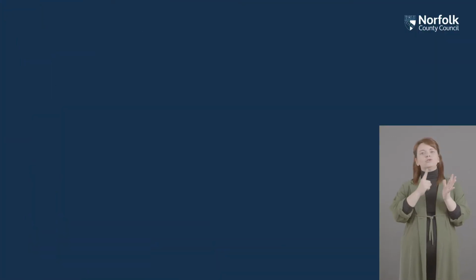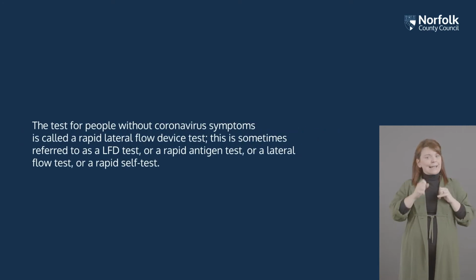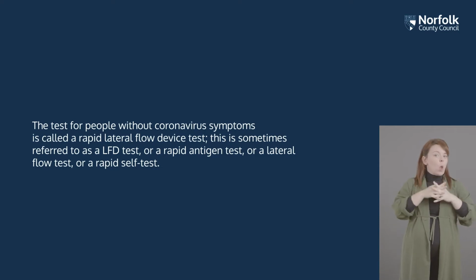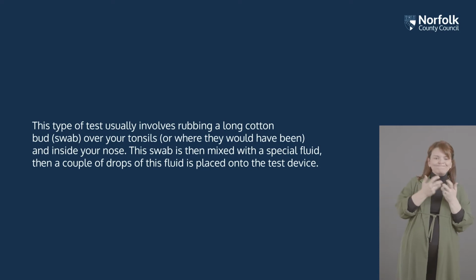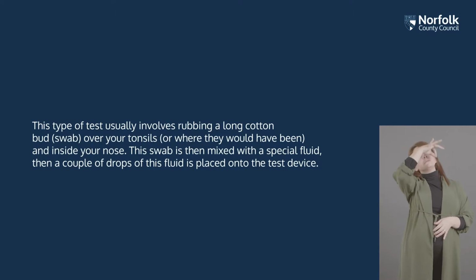What is a lateral flow device test? The test for people without coronavirus symptoms is called a rapid lateral flow device test. This is sometimes referred to as an LFD test, or a rapid antigen test, or a lateral flow test, or a rapid self-test. This type of test usually involves rubbing a long cotton bud swab over your tonsils, or where they would have been, and inside your nose.